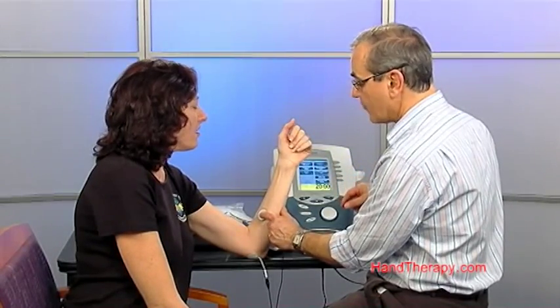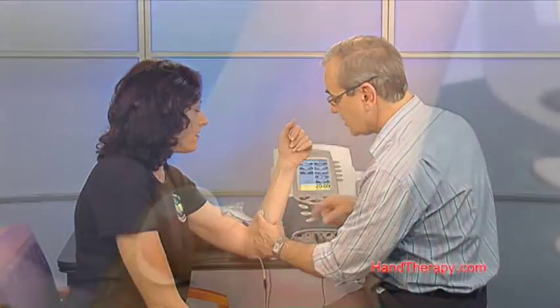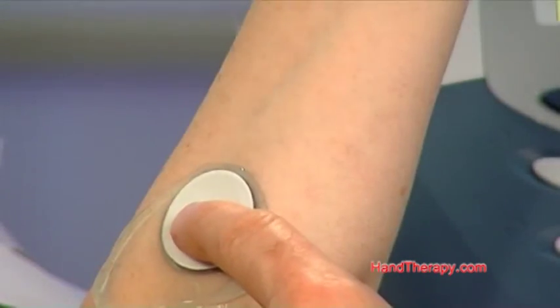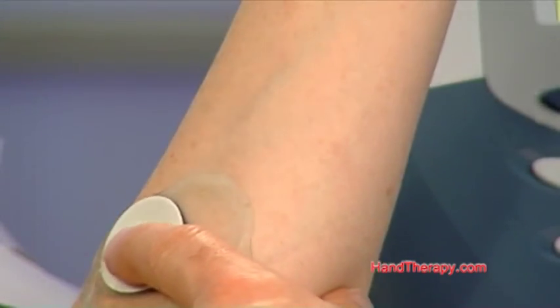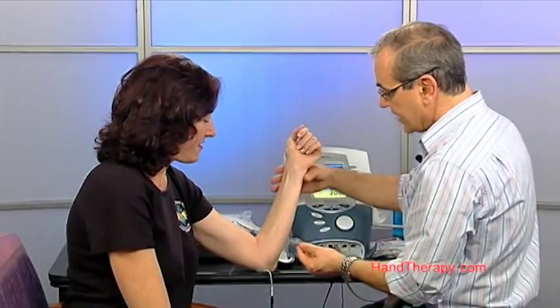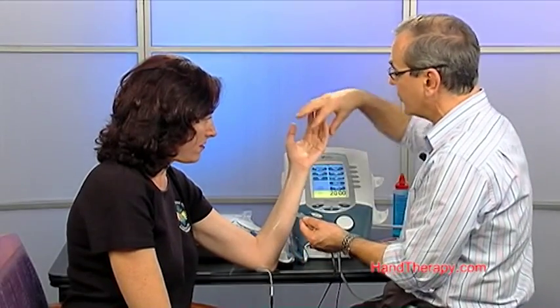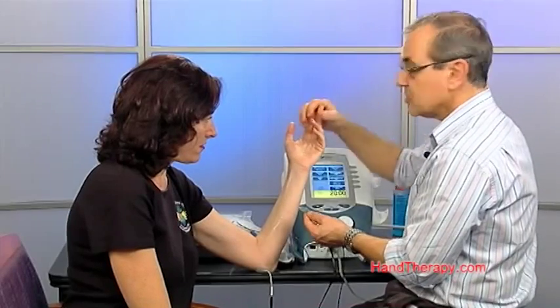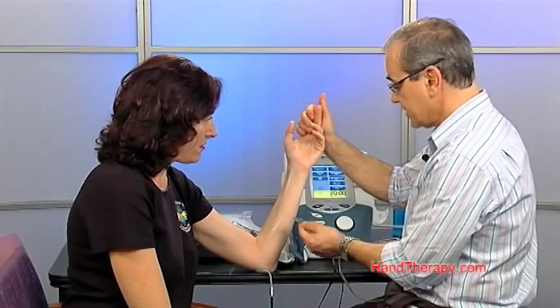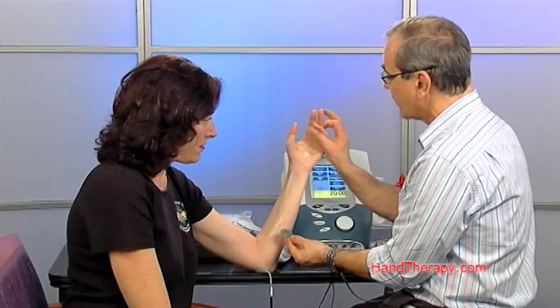Now I'm coming off her motor point and you can see her muscle contraction reduce. I'm going to use this probe lead to find the flexor digitorum profundus. I'll hold Susie's fingers up and move over the motor points of the FDP — what we should see is the small finger and ring finger flex strongly with initiation at the DIP joints.